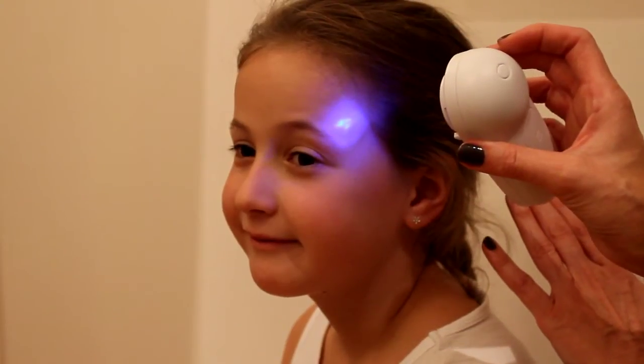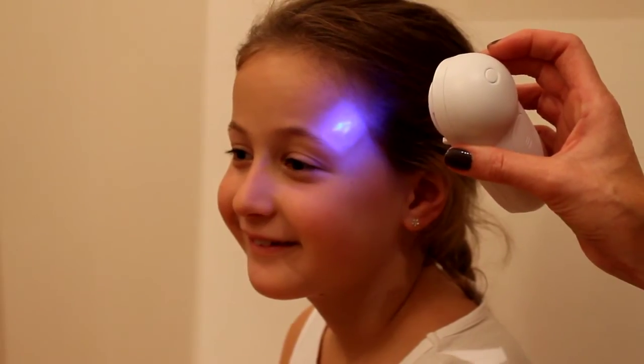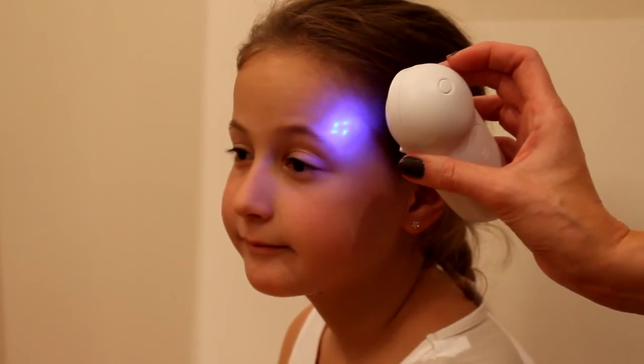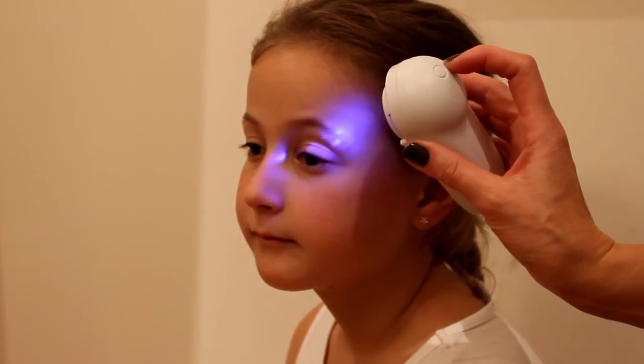You can zoom out and you will notice that the dots are not clearly visible, indicating the thermometer is too far away. Moving in closer, you will see the dots clearly, and this is the correct distance.